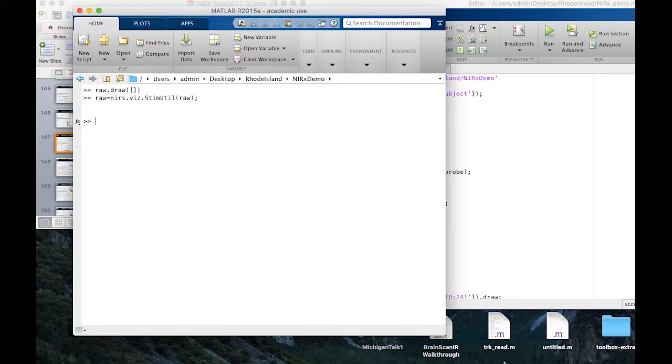Right, so you have, let's say, some set of channels that activate from the task, and some subset of those that were responding selectively to reaction time. Maybe these parts of my brain just react to the task, but only this part of my brain is actually changing when I become faster at the task. That's, in fMRI, what's called a parametric design.